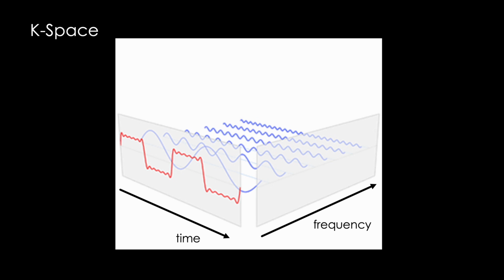So when a course shows you this picture and says we go from real space to frequency space, you naturally think, what do you mean? What happened to time? Your gut was onto something. We can never stop the flow of time, and time remains a major player in this thing called frequency space.